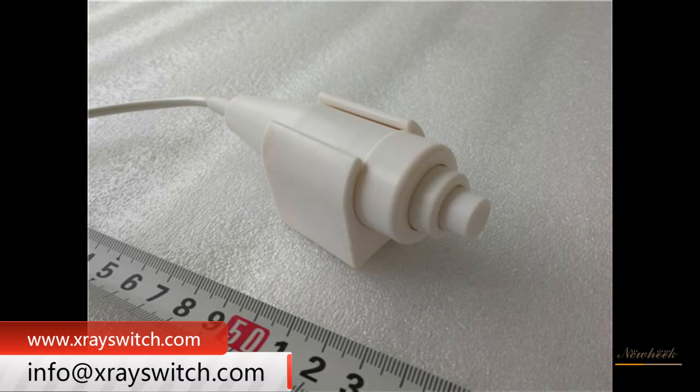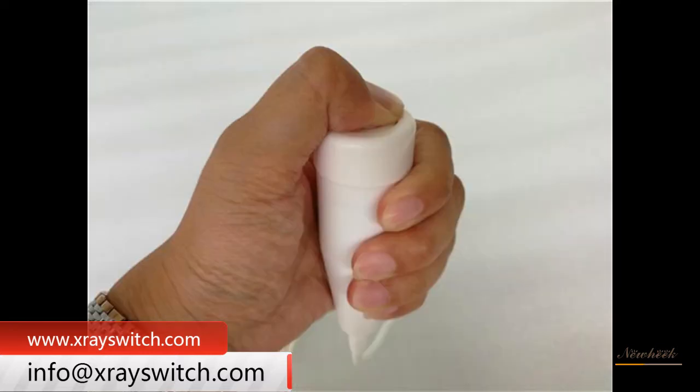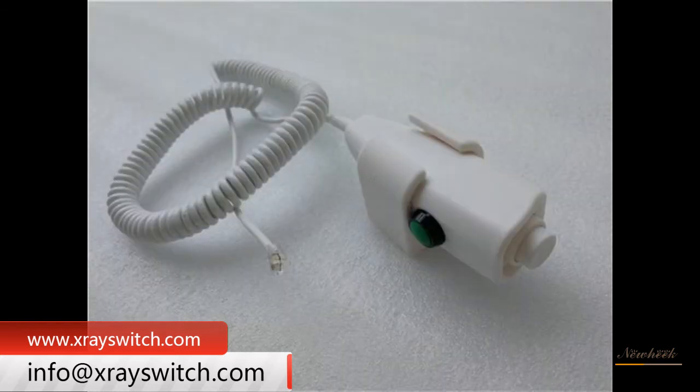The hand switch wire has 3 cores, 4 cores, and 6 cores. 6 cores are usually for 3 switches. The X-ray hand switch comes in a length of 3 meters with a stretching range of 2.2 meters, 6 meters with a stretching range of 5 meters with 3 and 4 cores, 10 meters with 3 cores, and 15 meters with 4 cores.